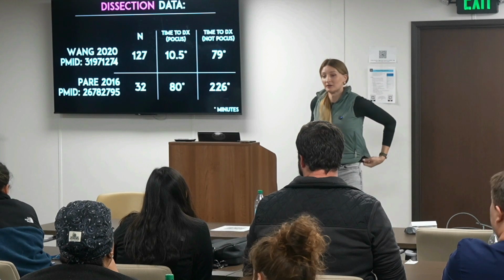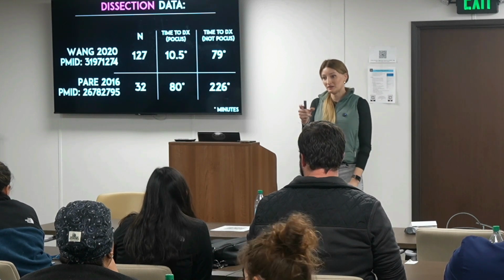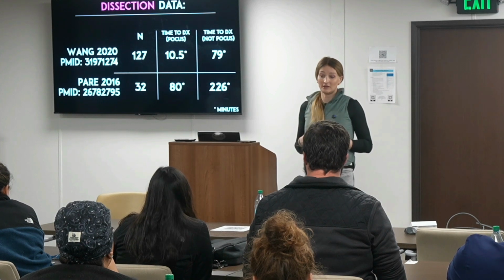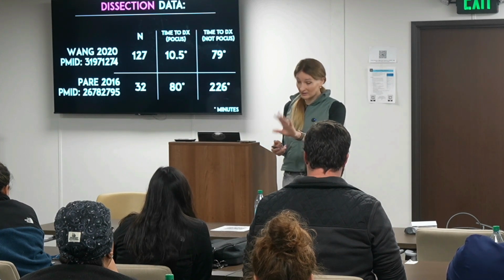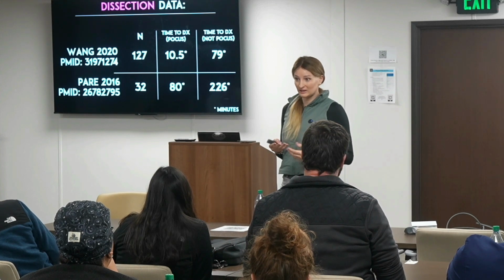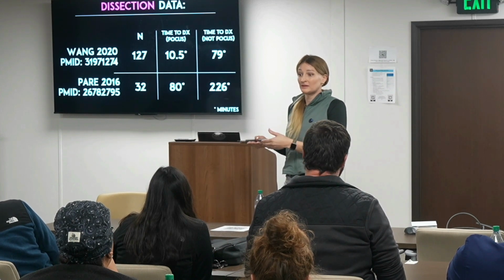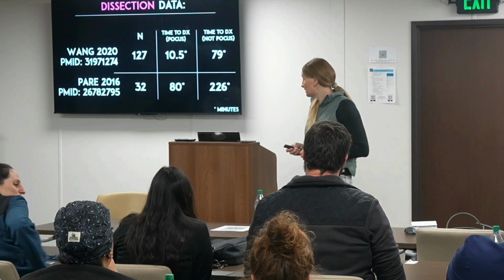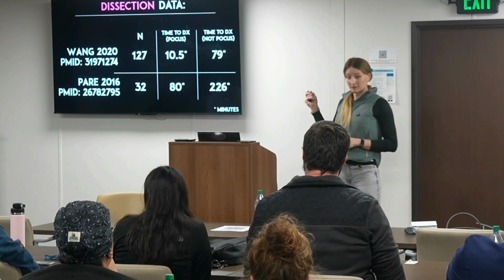No, it wouldn't. It would be normal. They have to not have a history of mitral regurg or diastolic dysfunction. So yeah, there's always caveats to everything. Truly, thank you for bringing that up. Like, no shade. You're totally right. There's always caveats to these kind of things. It's assuming that you have a normal left atrial size. Absolutely. Great question. All right, we good with these numbers?